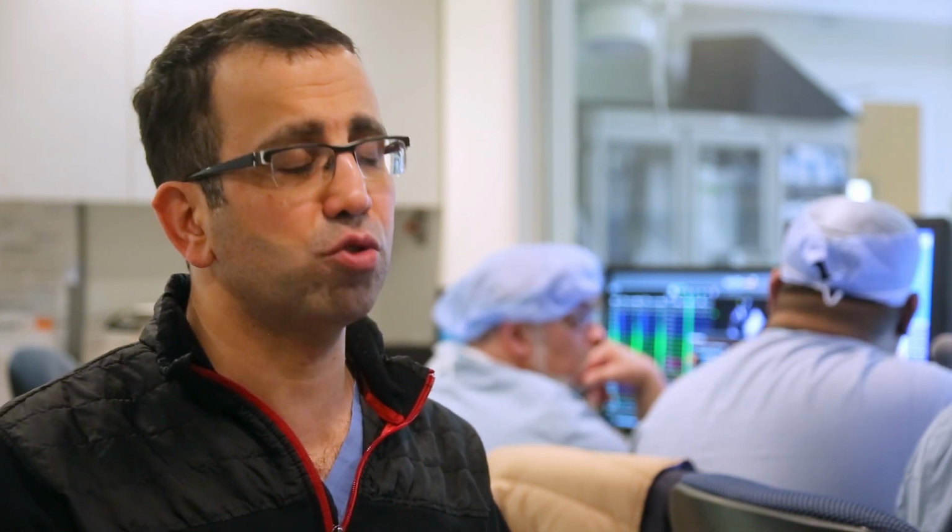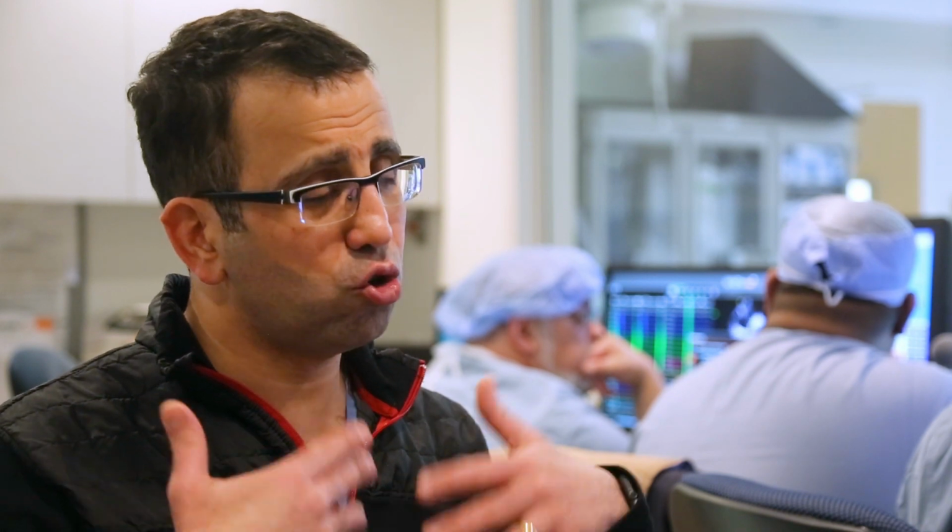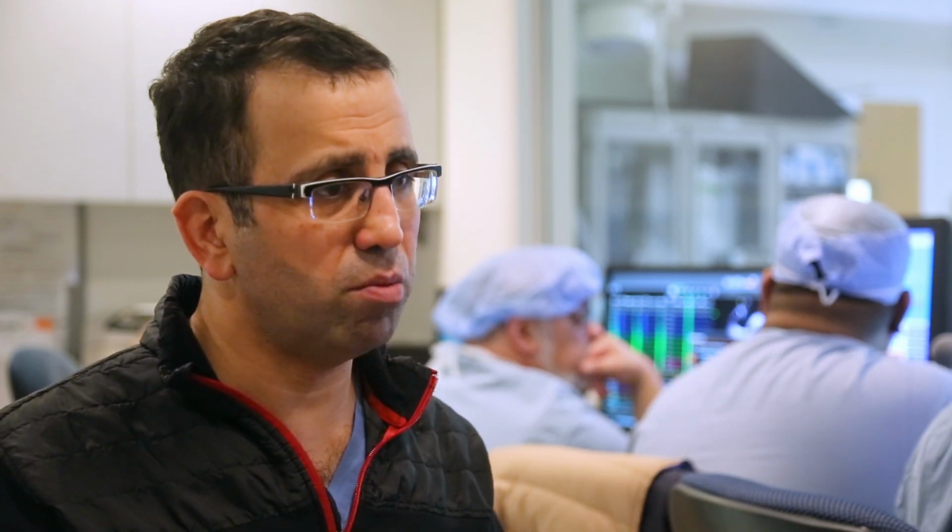If you do have a trigger, you have to remember that we can't say exactly what area in the heart specifically is responsible for these triggers. We are just reliant on the electrodes that we have in the heart and the resolution of those distribution. So if we did have a trigger, we will shock the patient on the isoprel back to sinus rhythm and move the catheters to zoom in on this area that looks to be early relative to the intracardiac electrograms, but also early relative to the P-wave morphology. And then we'll repeat the same thing.